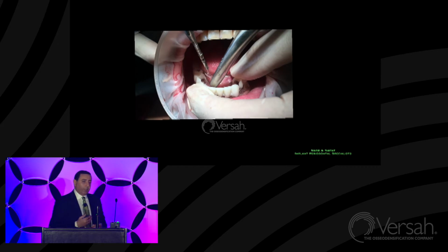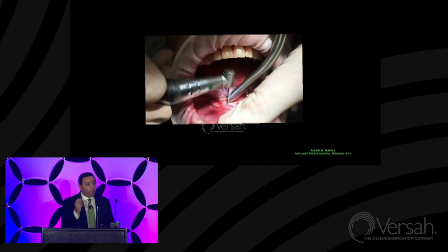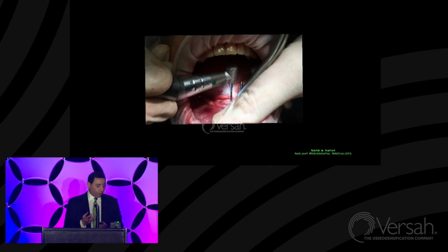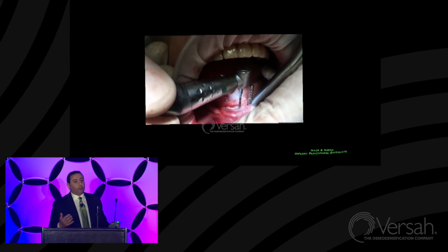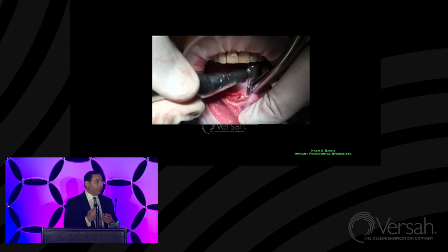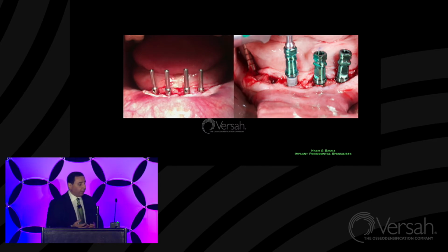Now I am doing a little bit less in and out motion because I'm pushing the bone first and then slowly backing out versus doing a pumping motion that you would do with a drill that cuts out the bone. And then the implants are ready to go in. We're using our parallel guides. We know that our last 2 implants, in order to emerge at a most posterior position for the loading torque to be idealized and have good support for the immediate temporization, we are placing them at an angle.